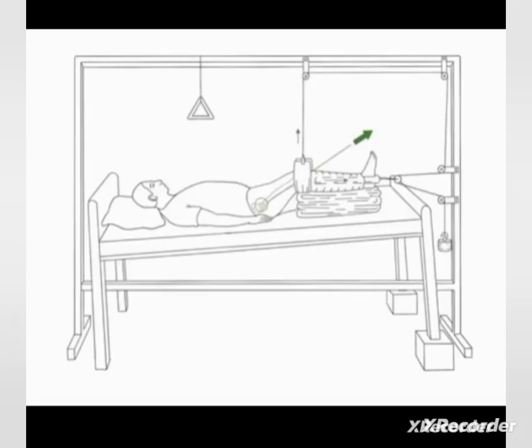Next one, Russell's traction. Russell's traction may be used in the treatment of fracture of the shaft of the femur. It may be applied as either skin or skeletal traction. Russell's traction creates a forward and upward pull on the leg by applying vertical traction at the knee. At the same time, a horizontal force is exerted on the tibia and fibula, like Buck's extension.